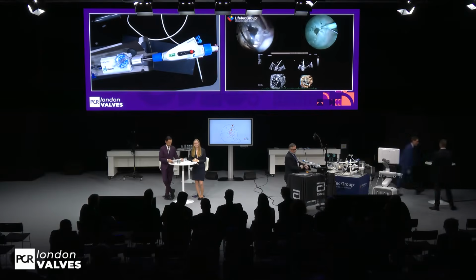All right. So let's go again from simulation room to real life, and we'll see the case resolution first of Philip Nicolai. So this is how we treat it.